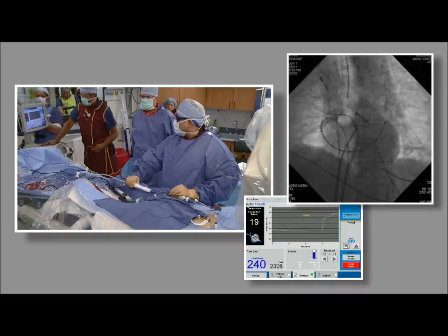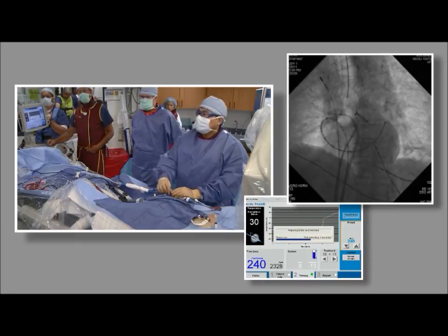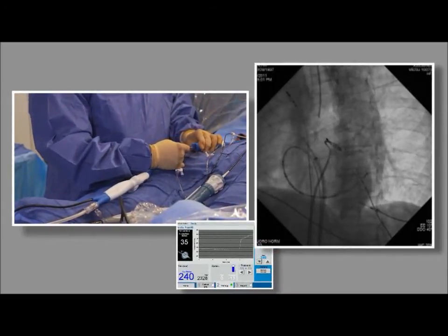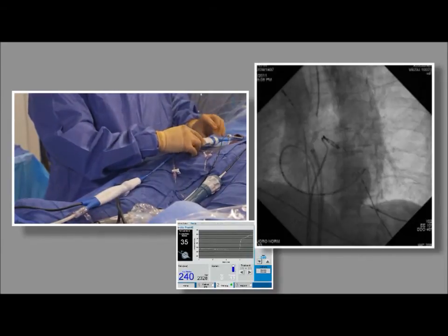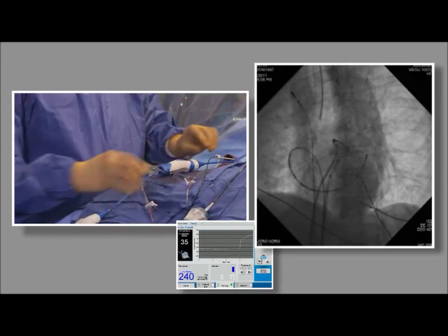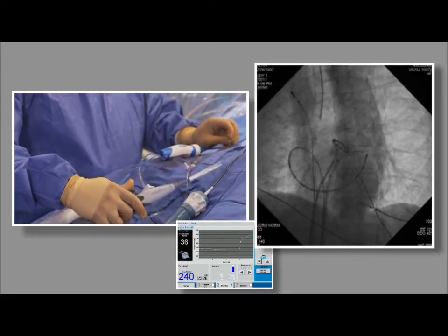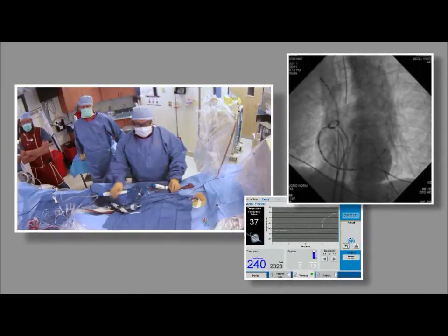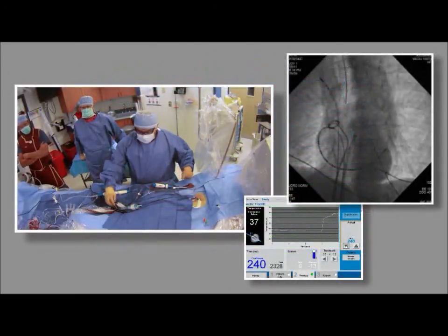That's taking about a minute to fall out. No PACs — excellent. Hasn't had a PAC in a long time. We had a lot of PACs to start with; some may have been from the PVs. The balloon is back in the sheath. Checking isolation — right inferior: inside the spiral is good. Right superior: the spiral is completely inside. I think we're done with the pulmonary vein isolation.